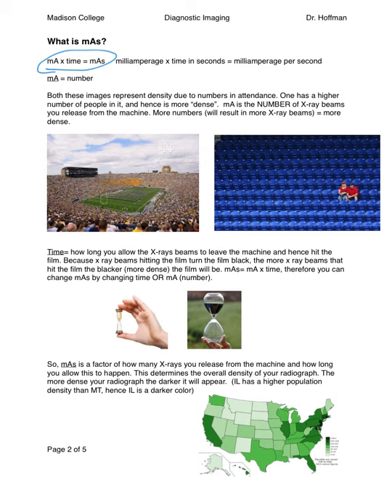So when we talked about KVP, we talked about force. Here we're talking about number. One thing that I like to think of with MAS is it makes your blacks blacker.